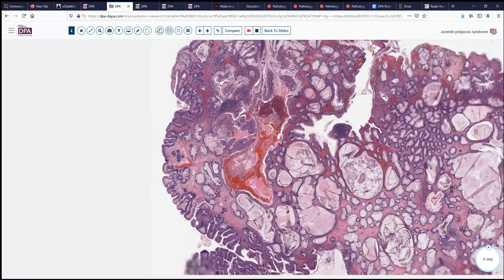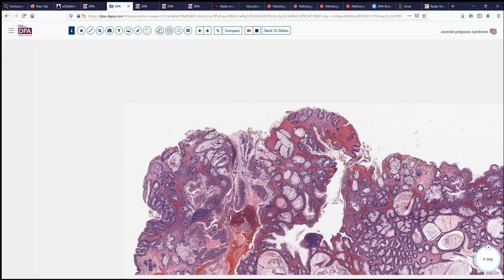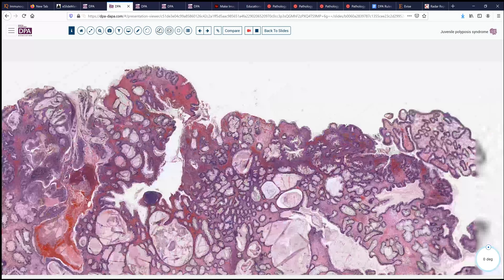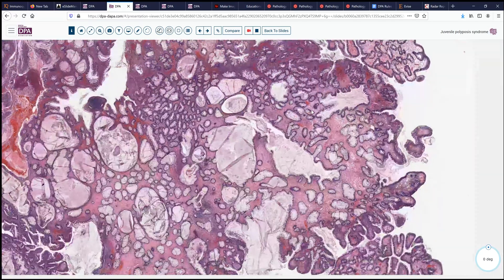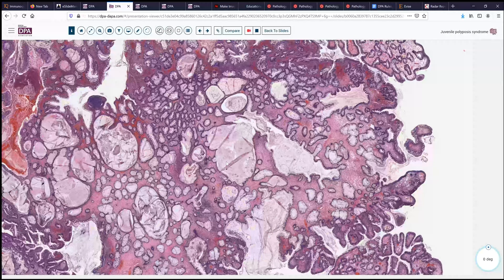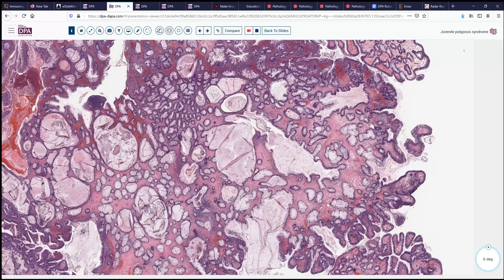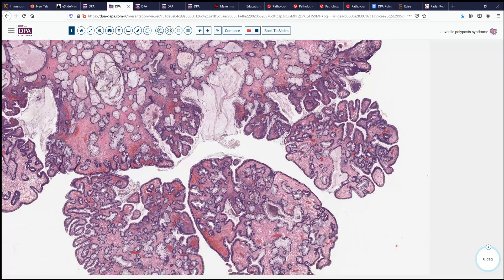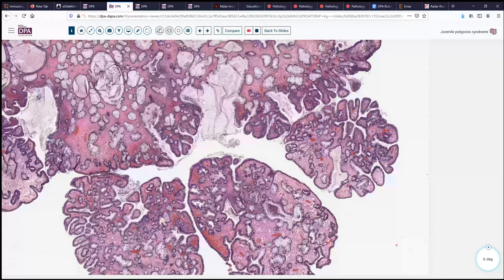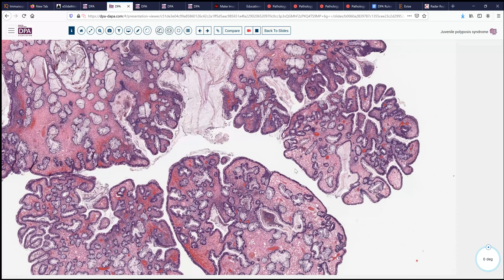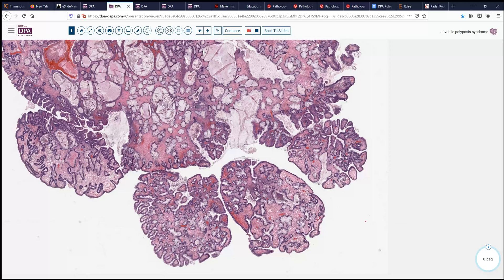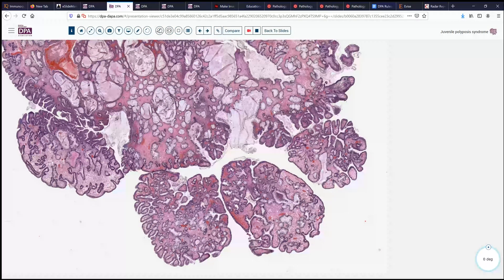There may be a little bit of ulceration and hemorrhage on this polyp as well. The theme is quite nicely complete with these large bulky polyps. Juvenile polyps can occur at pretty much any site in the GI tract, but they are most common in the large bowel — hence what we've seen so far is strictly colonic type mucosa. They can also occur in the stomach or small bowel, where rather than seeing colonic type epithelium, we would expect to see gastric or small bowel type mucosa.